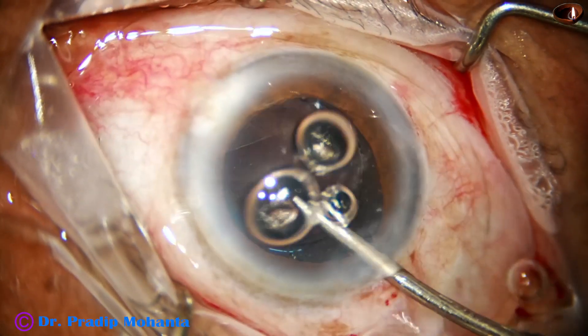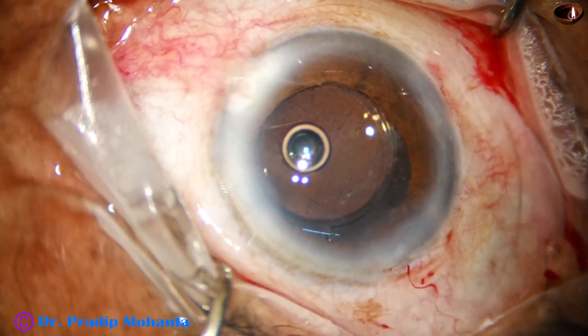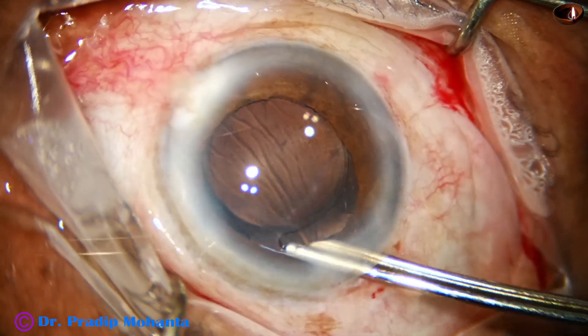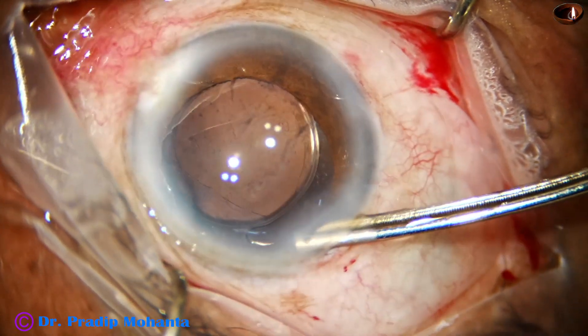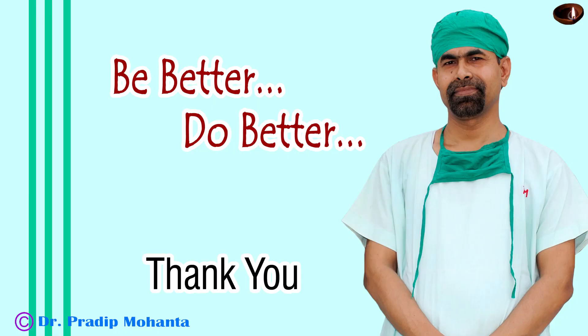The final lavage of the anterior chamber is done, air bubbles are removed, the anterior chamber is nicely formed, and the case is concluded. Thank you very much for your attention.